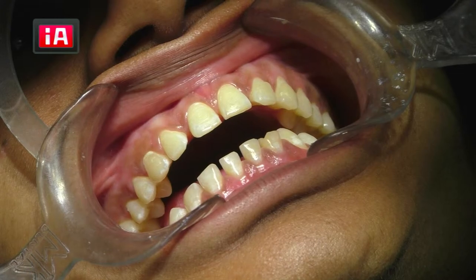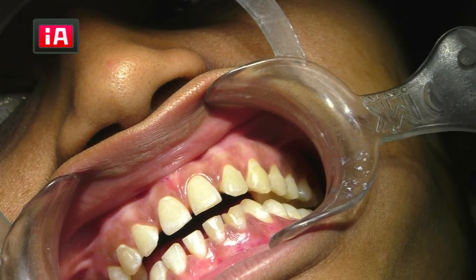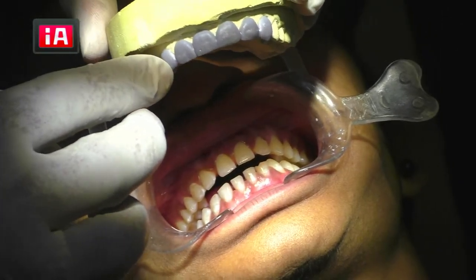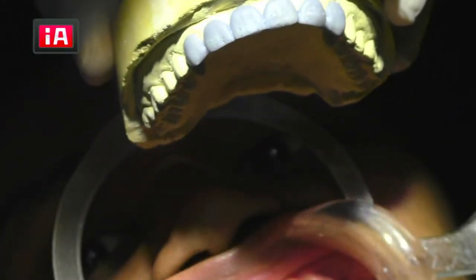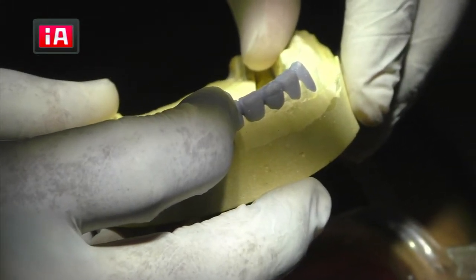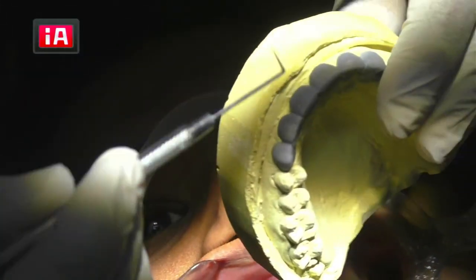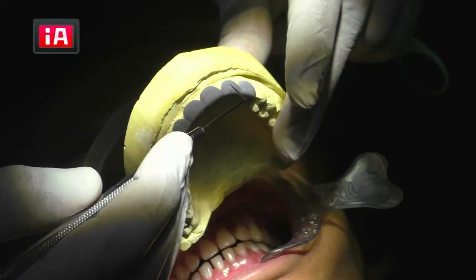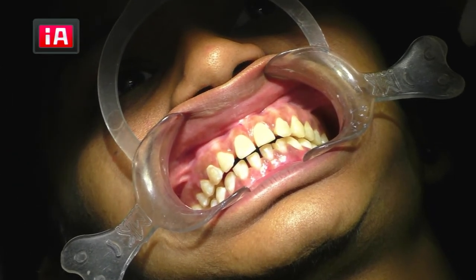So we have done a mock-up, with the tooth, just to make her understand how the space will be closed. For canine to canine, we did a mock-up with 3D printing. And for the lower also, in the same way, we did a mock-up using 3D printers. So this is the mock-up we have done. We educated her that the tooth may look a little wider in nature, but we'll try to close the space and make it as proper a size as possible by giving an illusion.